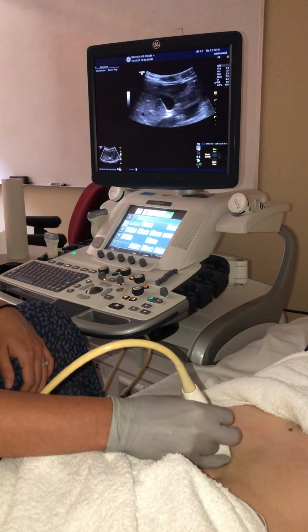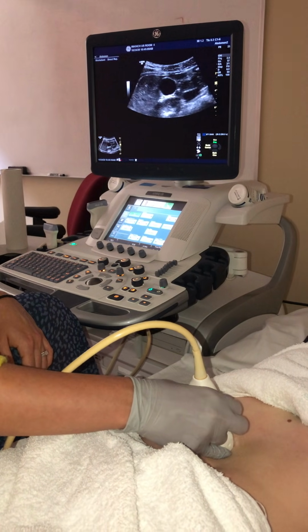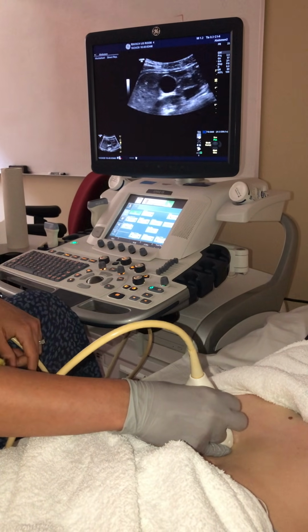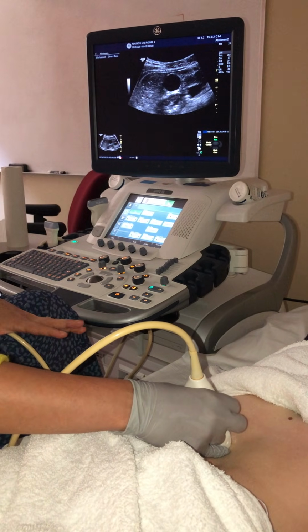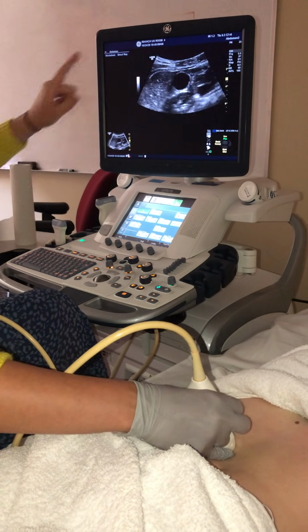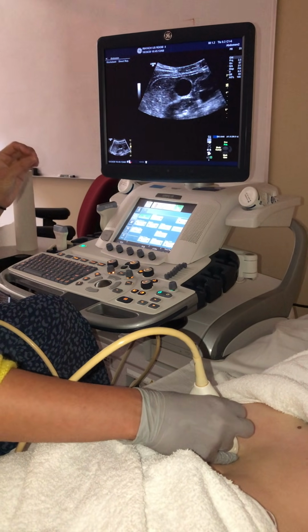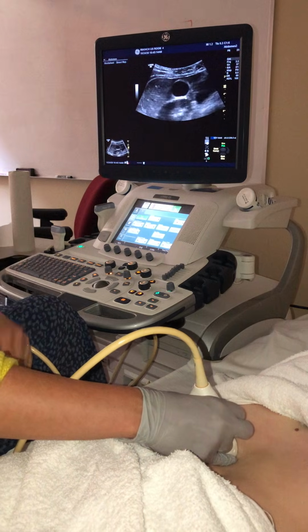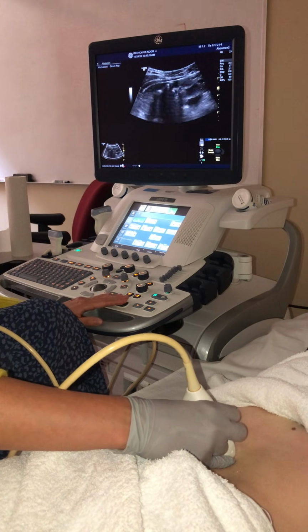So if you look at my transducer now, we're almost opposite that angulation that we had for the sagittal. So we want to forget what our hand is doing for a second and we want to focus on what the organ is doing. So we know in transverse we want the cross axis of the organ, so we want it nice and round. So this is a good transverse. Sorry, I didn't tell you to breathe. Another big breath when you're ready.